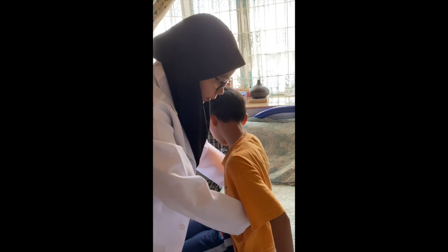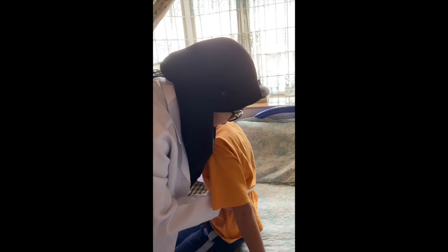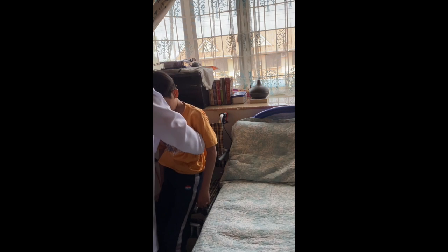Now I will ask the patient to stand up on the count of three. So one, two, three — assist the patient to stand up. Move the patient in front of the wheelchair and assist them to sit on the wheelchair.